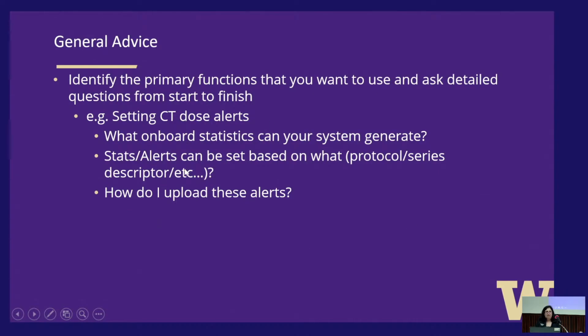I mean, even yesterday morning, I got an email from one of the technologists who's trying to justify alerts in Dosewatch. You cannot turn off the monitoring when the contrast is injected and you're just monitoring. We don't want to send an alert for that. But unfortunately, with Dosewatch, that also causes an alert.